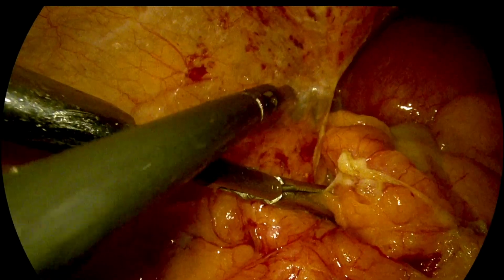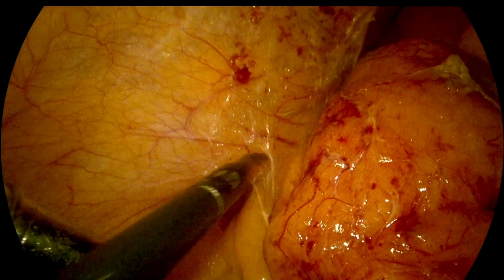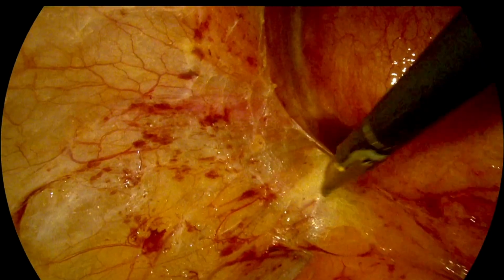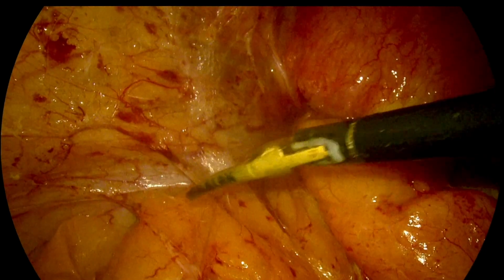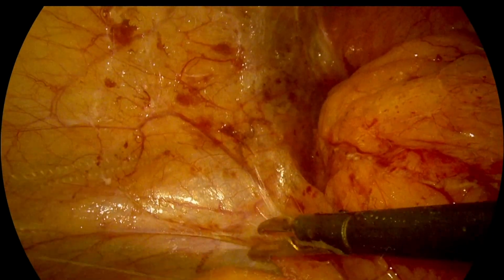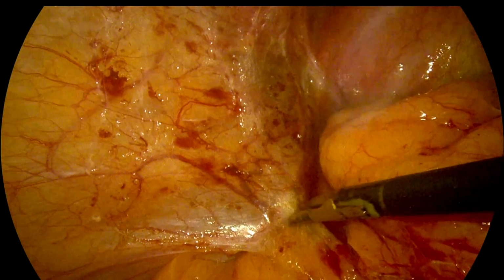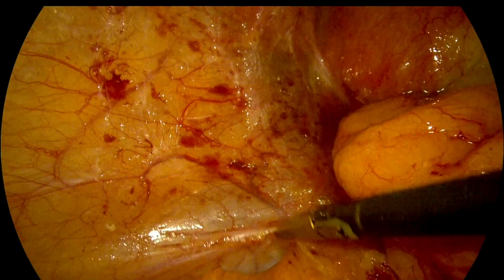So it is better to divide these adhesions in the avascular plane between the omentum and the abdominal wall, which is the faster way of releasing adhesions. Definitely, without releasing these adhesions, we should not pull them. Otherwise, in some places they may be vascular and can lead to bleeding and stain the surgical area. So these are some more adhesions that are being released.